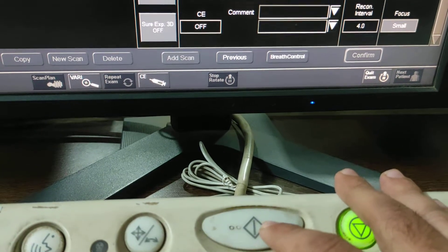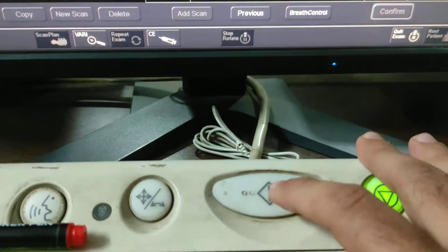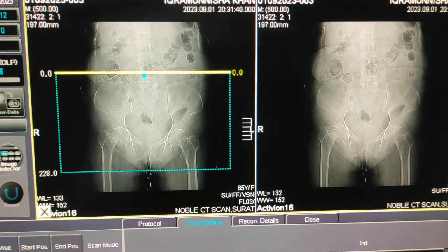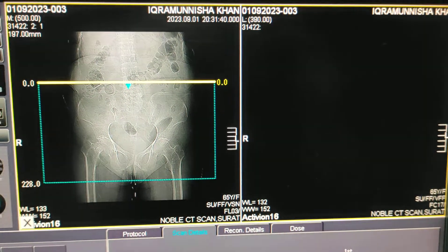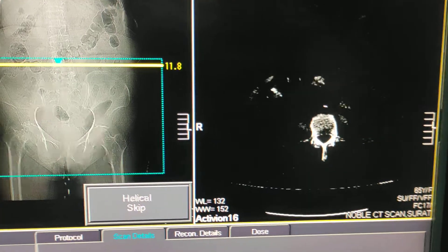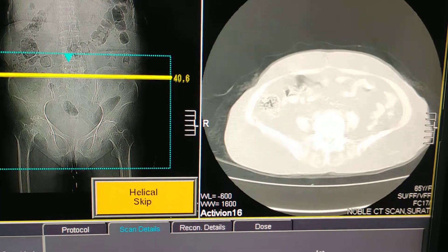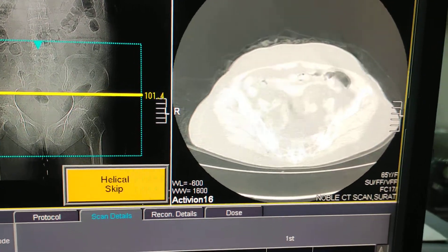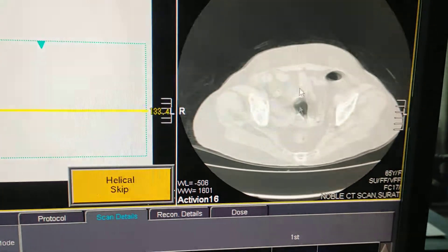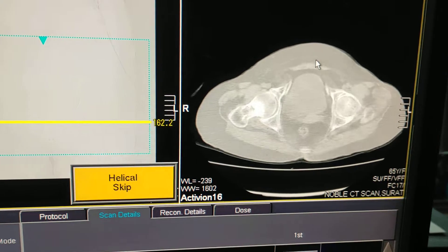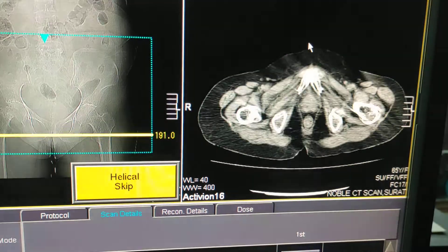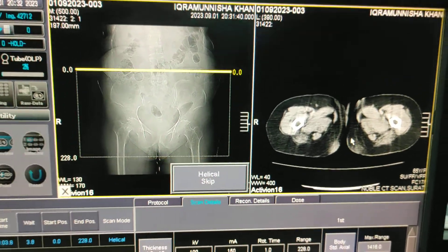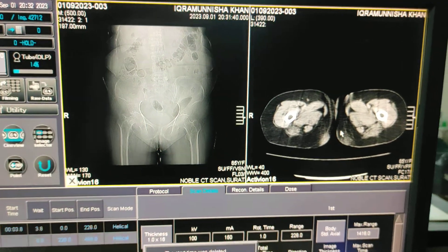Before you start scanning, give proper instructions to the patient not to move. Now start the scan. You can see the images appearing as the scan progresses. The scan is now over.